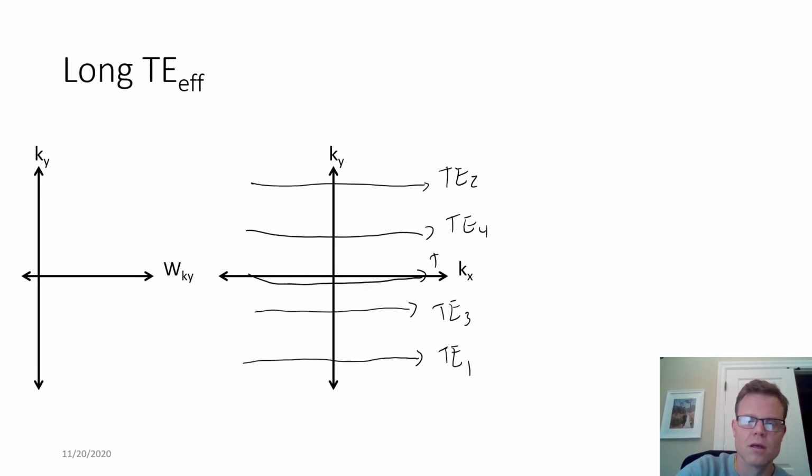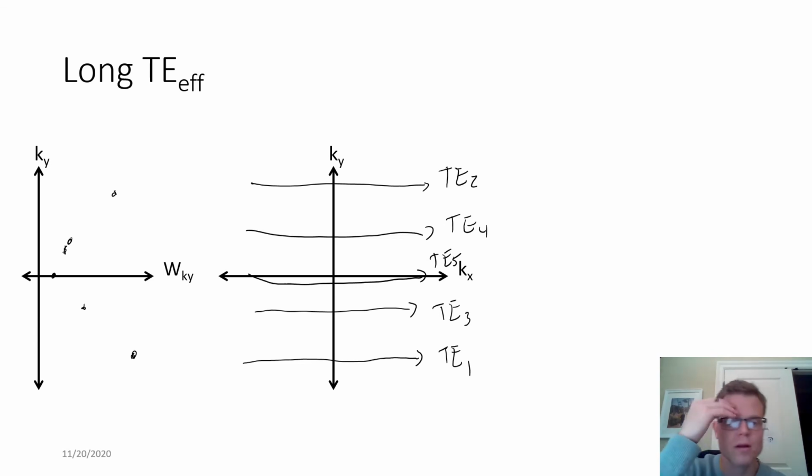And with our last spin echo or our last echo time, we'll cover the center. So we'll get sort of the lowest signal weighting when we cover the center of k-space. And so this, of course, would be good for T2 weighted imaging.